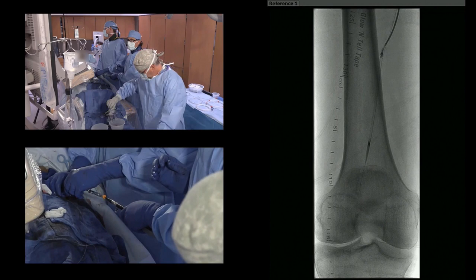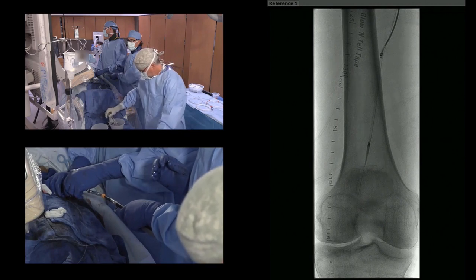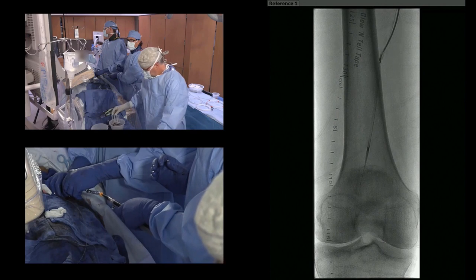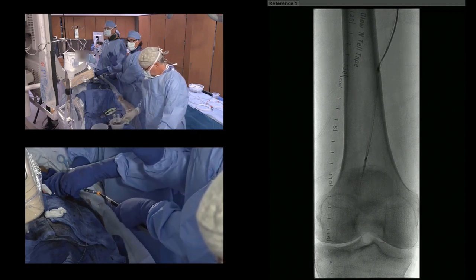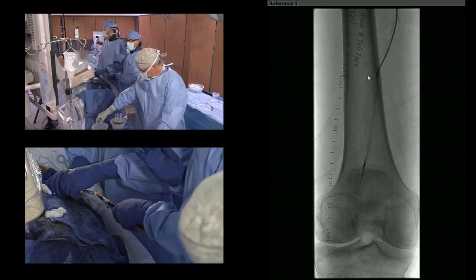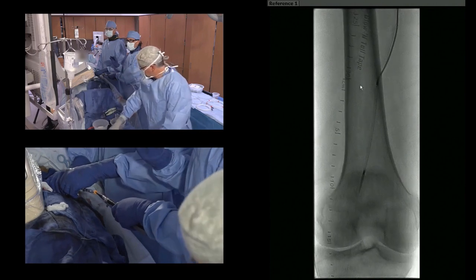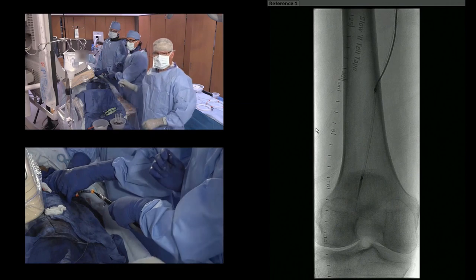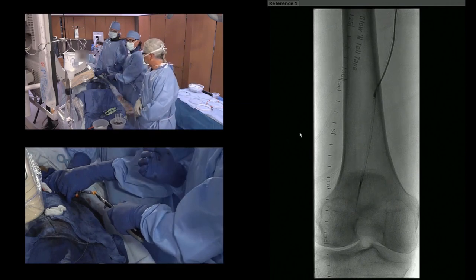One thing I really like about directional atherectomy that's unique is that this particular device gives you lots of feedback. And so you notice that we're shaving with the blade facing screen left. So I can actually watch the blade interact with the plaque, make sure it's holding its line through the plaque and not bouncing.